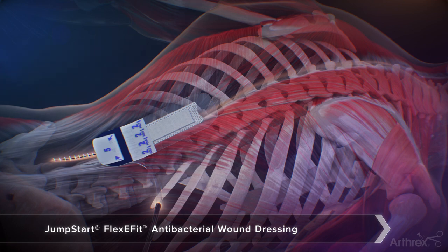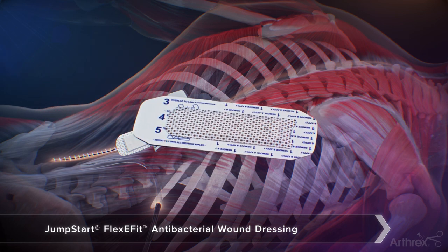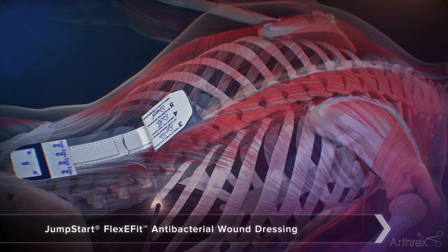For incision lengths that require more than one FlexiFit dressing, additional dressings can be attached in a daisy chain fashion, accommodating incisions of all lengths. To link an additional FlexiFit dressing to the first, fold back the liner labeled 2. Repeat adding Energel to the second dressing. Remove the liners labeled 1 and place on top of the distal portion of the first dressing, pressing down gently to ensure direct contact. The previous steps can be repeated as many times as necessary until the full length of the incision is covered.